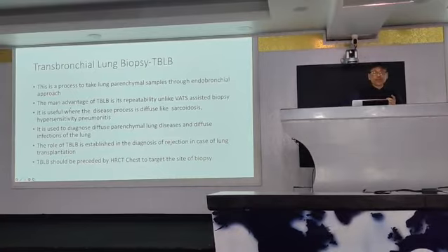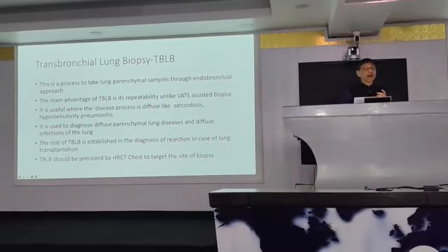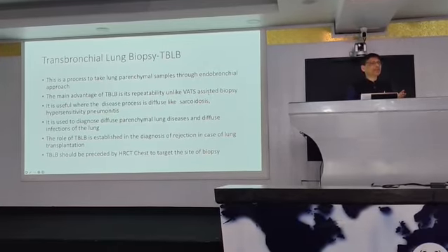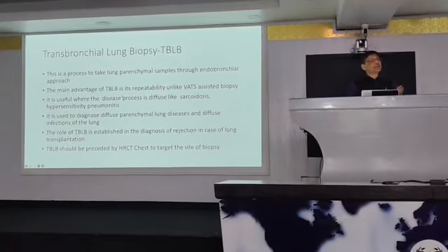The main advantage of TBLB is repeatability, unlike VATS-assisted biopsy. VATS is video-assisted thoracoscopic surgery. It cannot be done repeatedly. It is a complicated invasive process. But this biopsy can be done repeatedly.